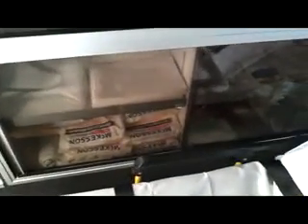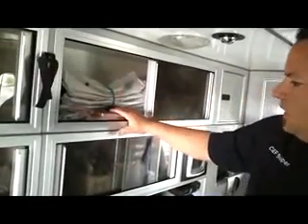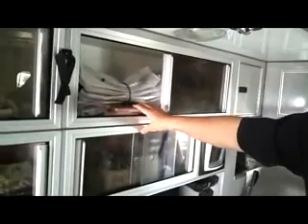This here is our advanced airway compartment. These are our oral ET tubes, endotracheal tubes. They go into the trachea if the patient can't protect their own airway. The paramedics can go ahead and establish an airway that way. BLS airways here, these are the OPAs.